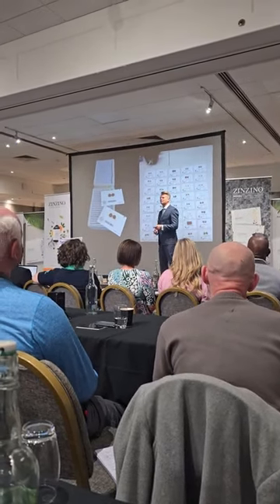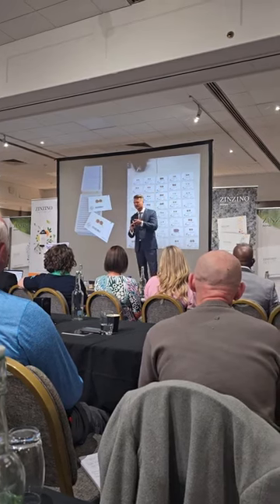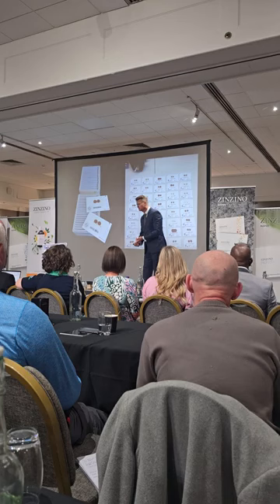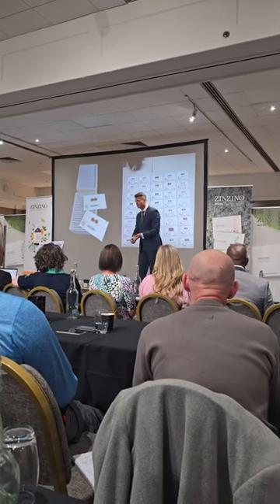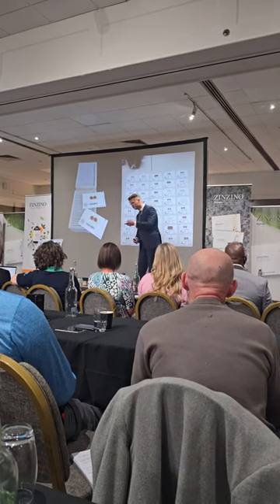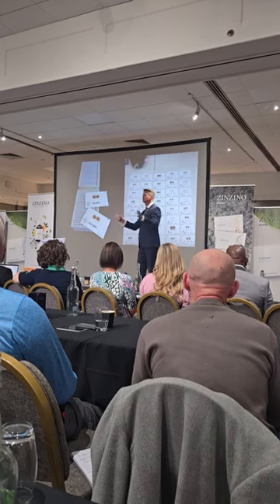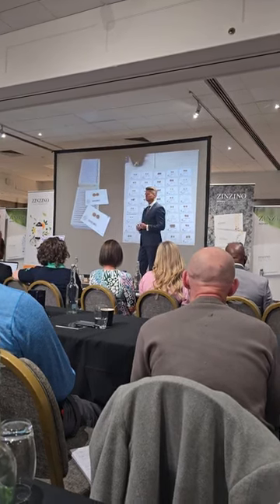So the perfect sample, how is the perfect sample collected? Well, you prick the lower side of your finger, you stand up, you have the paper on the table, and you squeeze like this, and you wait, and you wait, until you have a big drop hanging from your finger, right? And you lower your finger to the paper, not the finger, just the drop of blood, and it will fill the circle like magic. That's the way to do it. Okay?